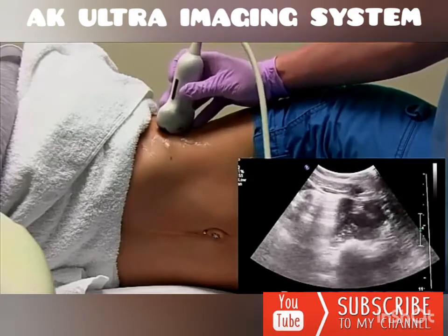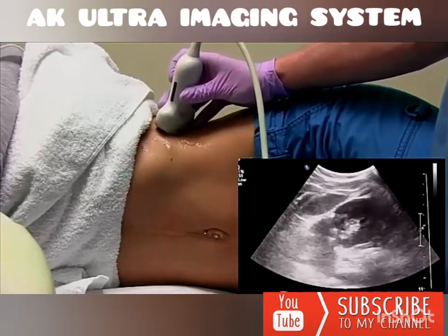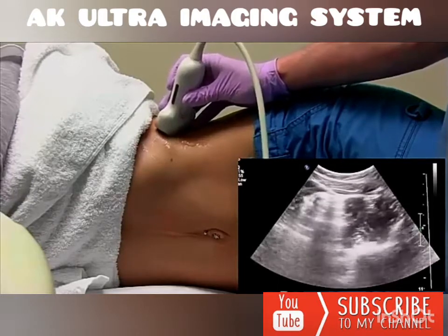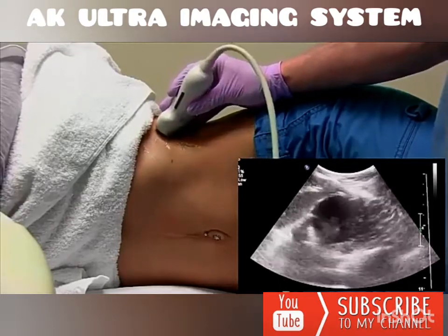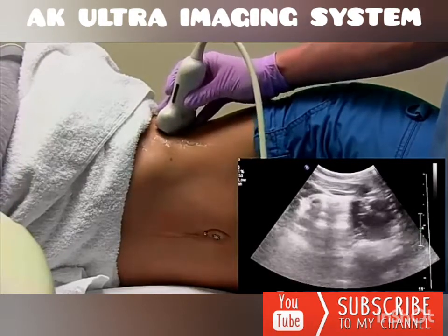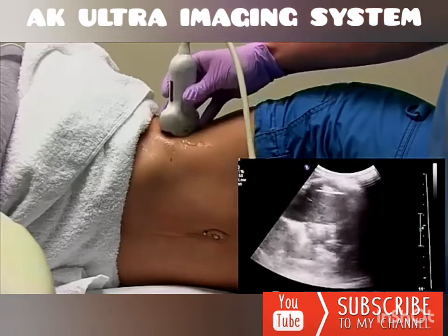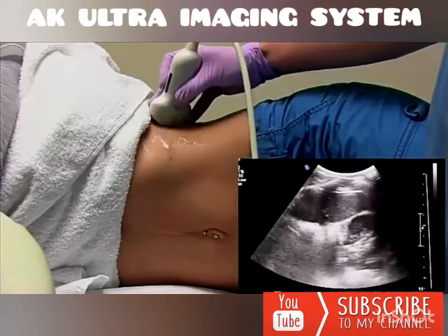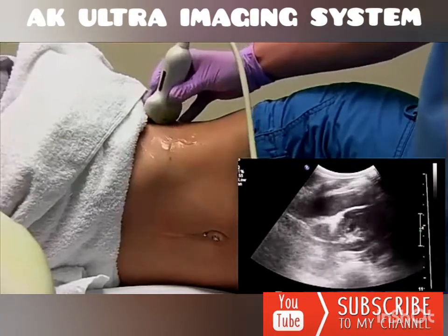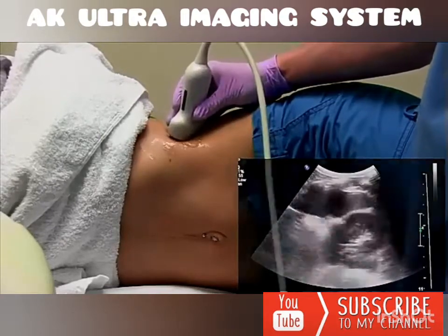For these transverse pictures, you may run into the ribs a little bit, and what I would do is, if you have to, you can use that intercostal space and just sweep through that if you feel like you're not getting a very good image of the upper pole or lower pole of the kidney. And you'll also see the spleen from this window again too.